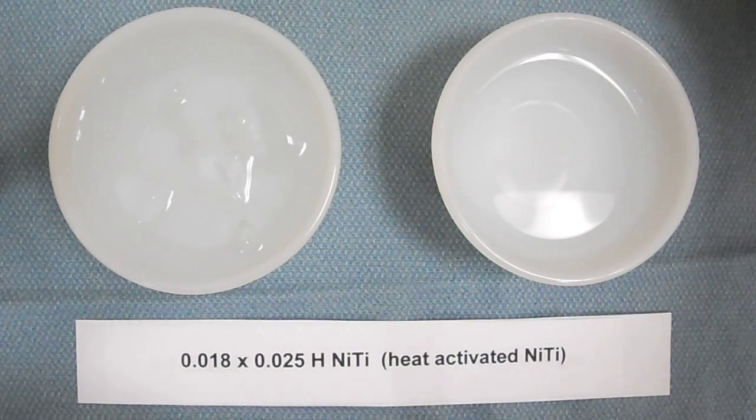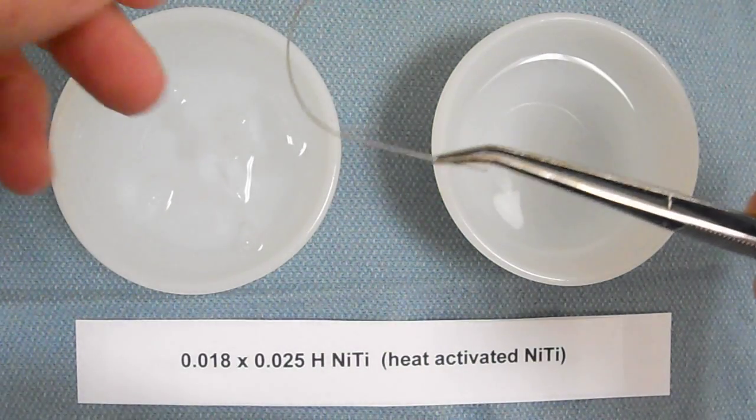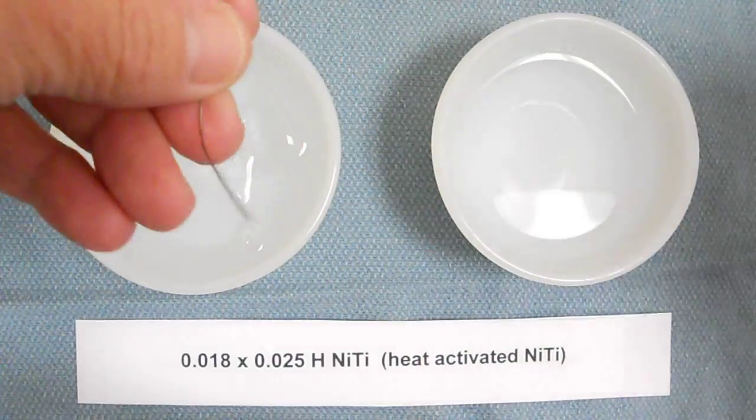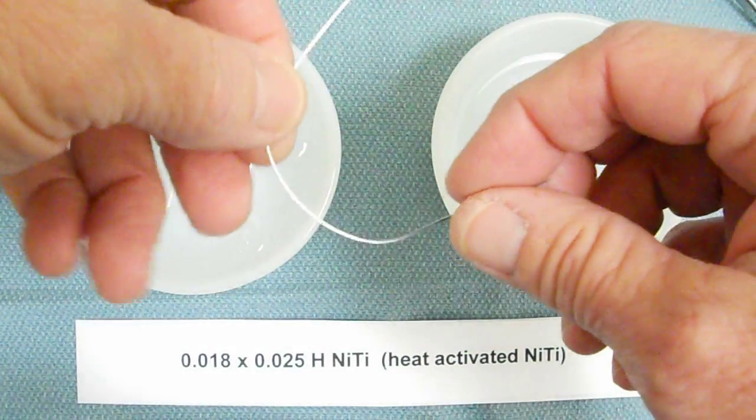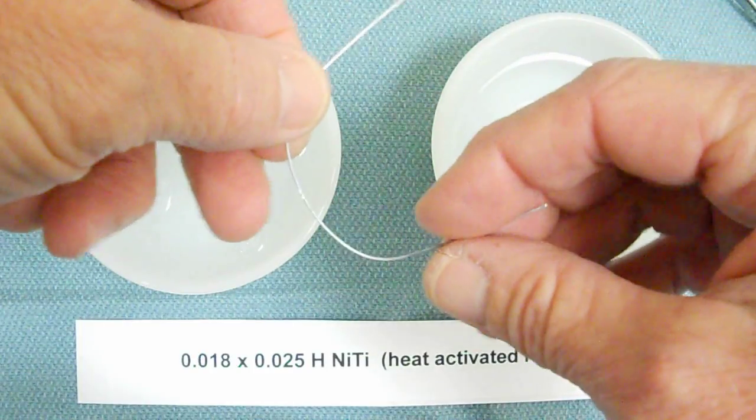Now we're going to look at something called 0.018 x 0.025 heat activated NiTi. The 0.018 and 0.025 are two dimensions to define a rectangular arch wire, and the heat activated property comes from being alloyed with copper.